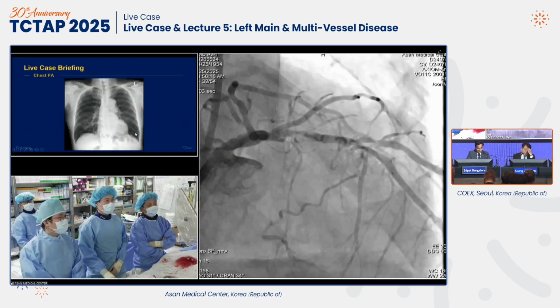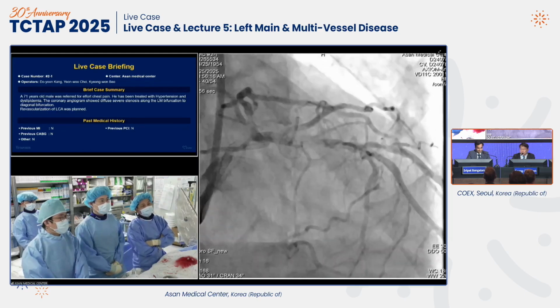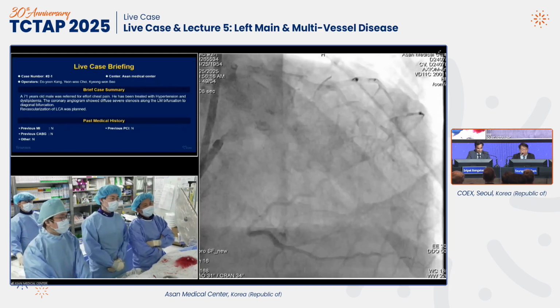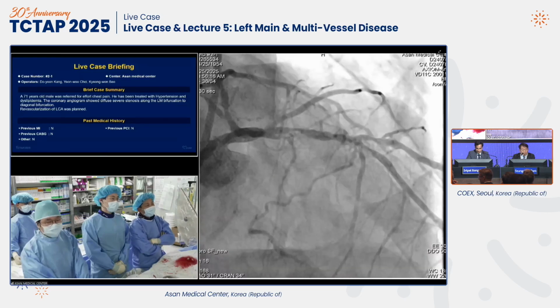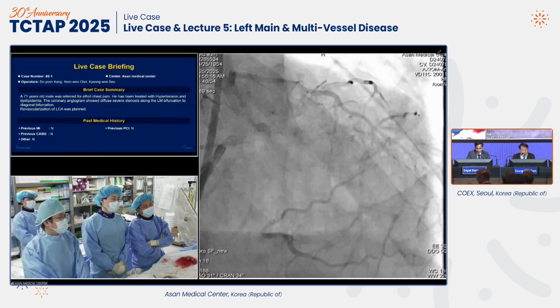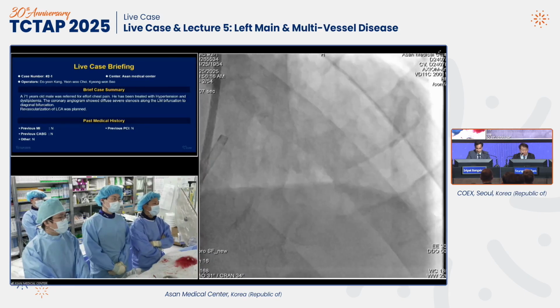I think the patient is a good candidate for CABG and also a good candidate for PCI. This RCA does not look like a CTO because we could check the angiogram and the RCA flow was very good. Only a very small, far distal circumflex vessel is fed by the collateral flow.